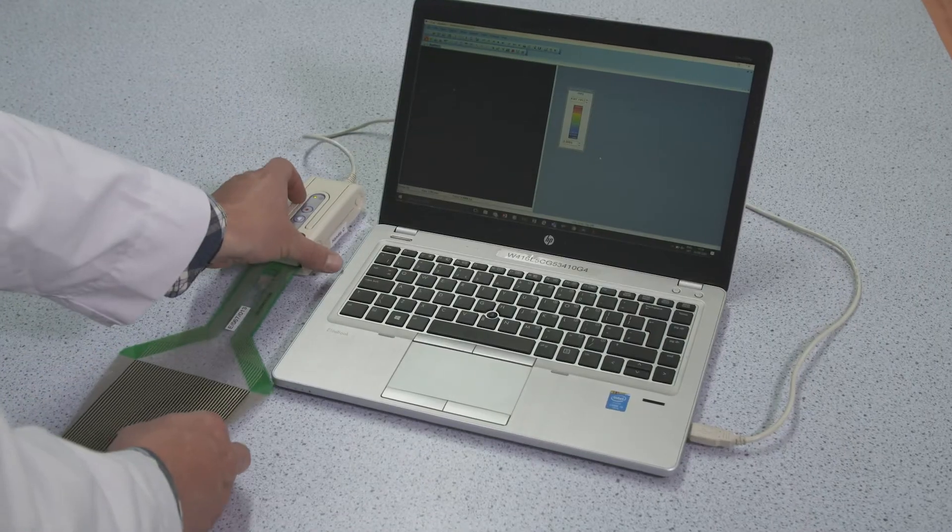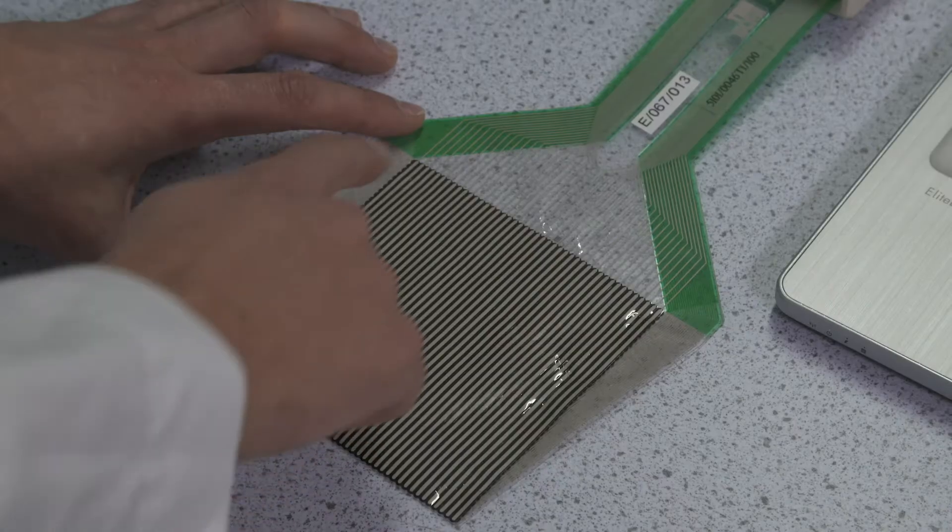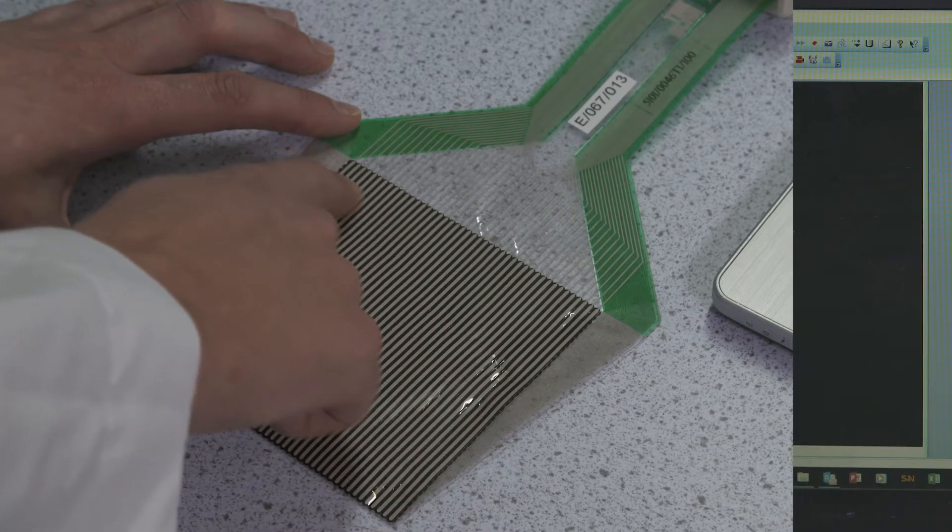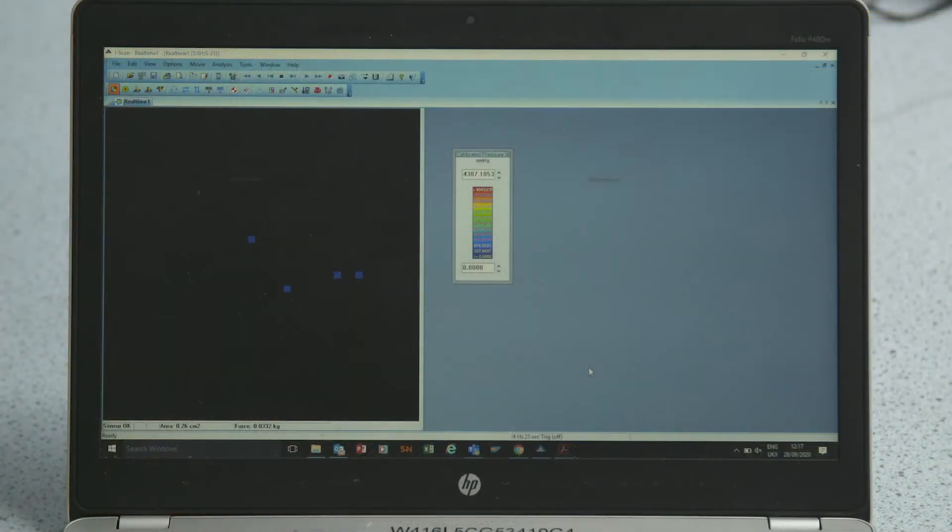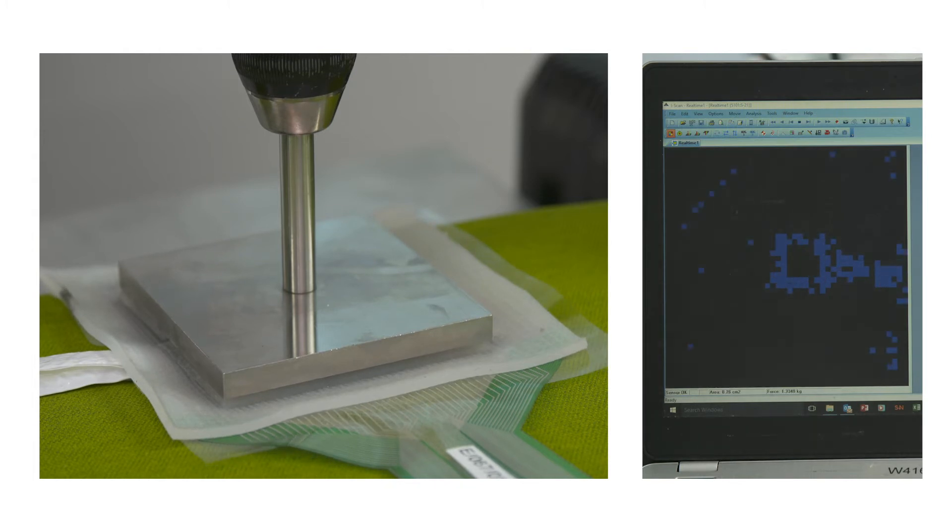We measure this using our calibrated Tekscan pressure sensor connected to the computer. This shows the pressure on the simulated skin before the Instron plate comes down. Now we can see the pressure on the skin after the Instron plate comes down.